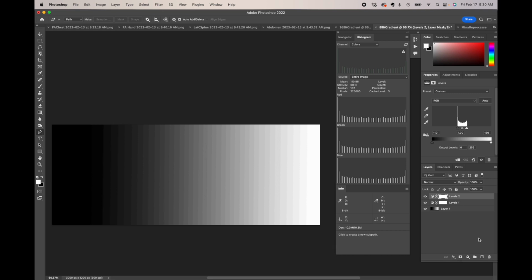So there's that, and then there's also the storage. You think of how much storage space all these different x-rays taken by a hospital in a single day take up, and how much that builds up over time, so it takes up hard drive space. An 8-bit file is going to take up a lot less hard drive space than a 16-bit file. And again, it all comes back to money and time.